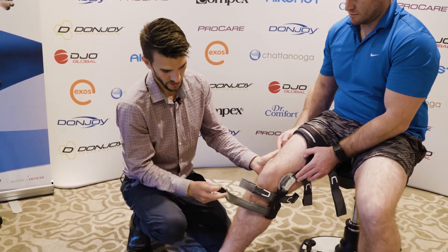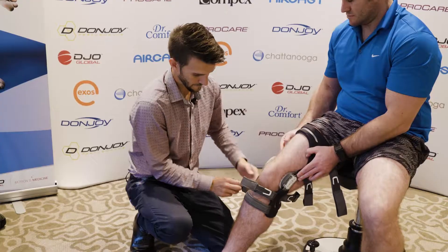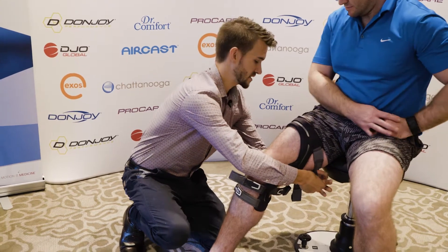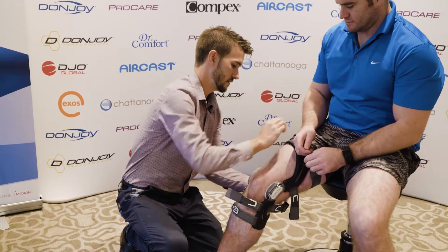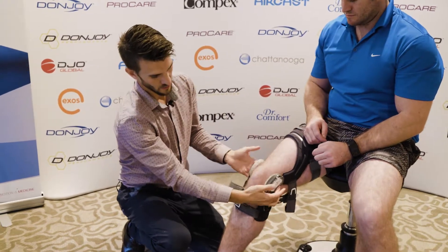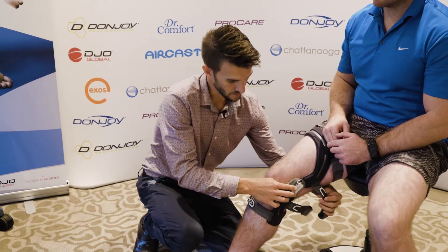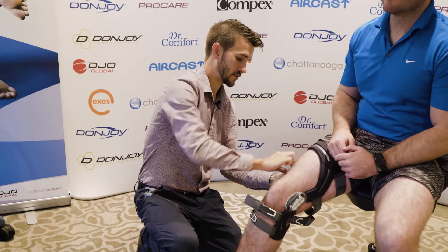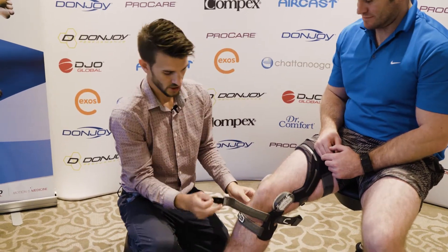Then it's just a case of following each of the numbers on the tabs. You start with the bottom one, number one, then the top one to fix the top of the brace. At this point the brace can move forward a bit, so it's important that it's sitting far enough back. Then pull strap number two around the back of the knee, number three, and the one in front of the shin is number four.